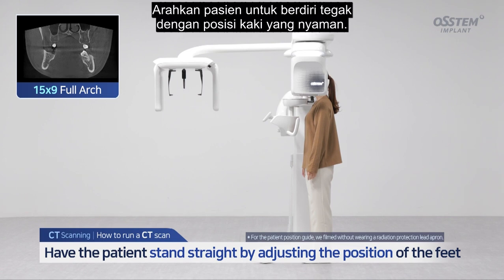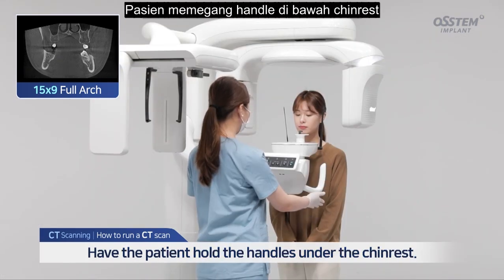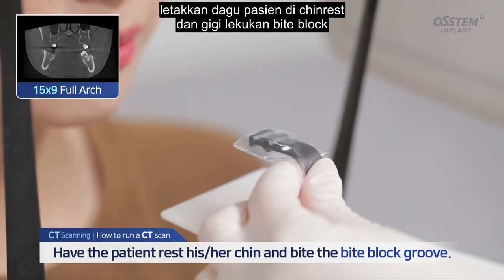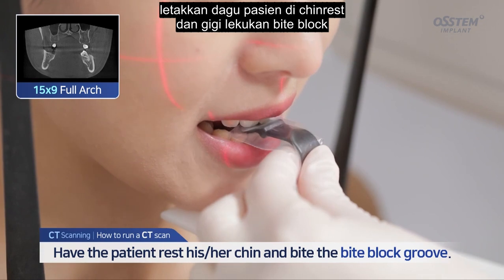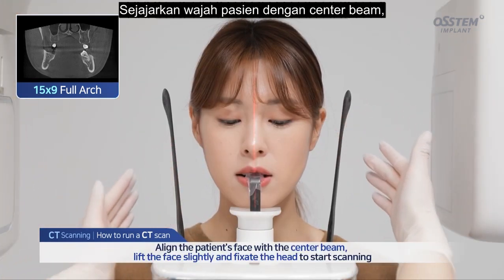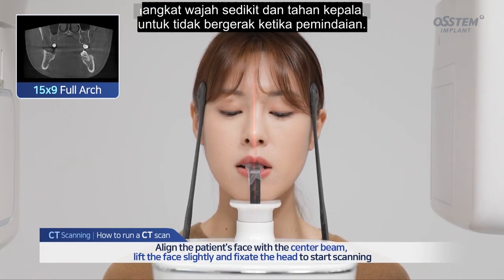Have the patient stand straight with their feet in a comfortable position. Have the patient hold the handles under the chin rest. Have the patient rest his/her chin and bite the bite block groove. Align the patient's face with the center beam, lift the face slightly, and fixate the head to start scanning.